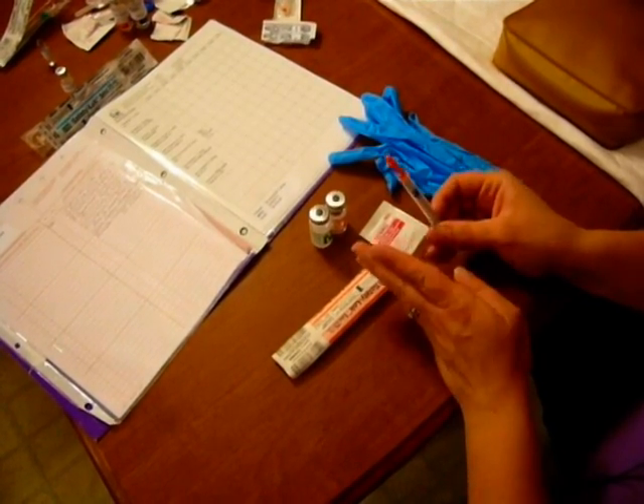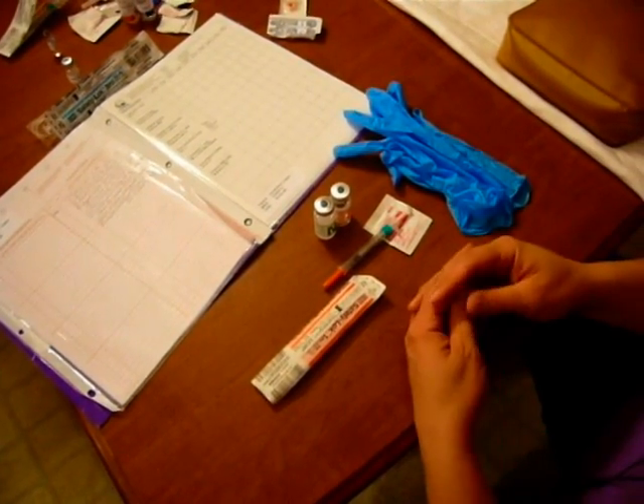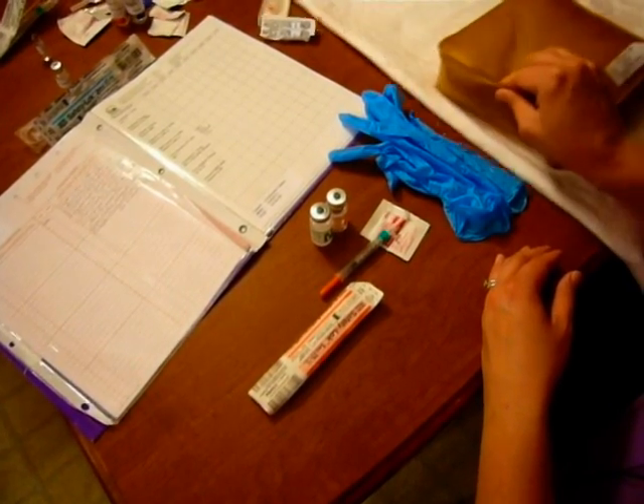Once we have that ready, we're going to transition to our patient. We need to make sure that we've washed our hands — if we were drawing it up outside the patient's room, we'll wash our hands once we get into the room, discuss with our patient what we're going to do, get them ready, and prep their site.